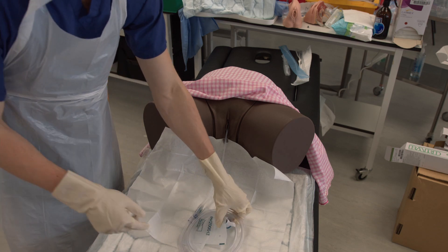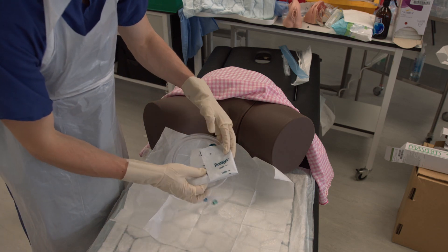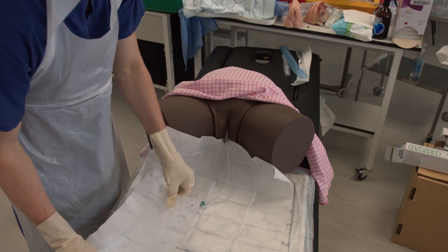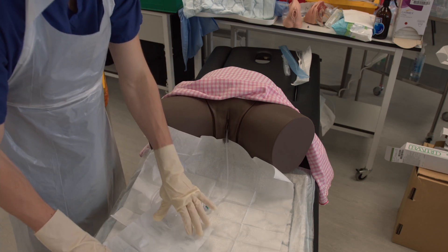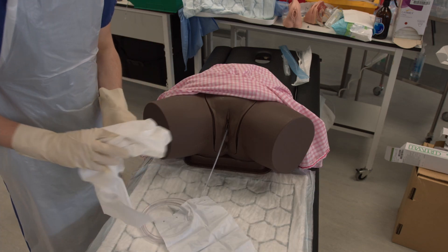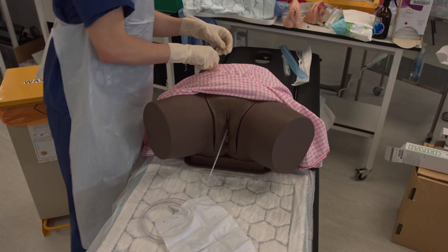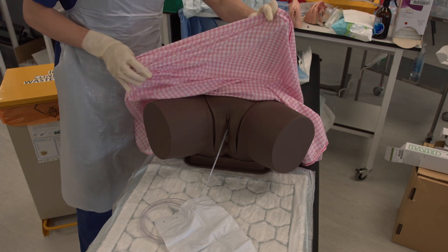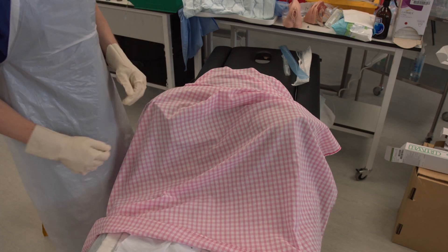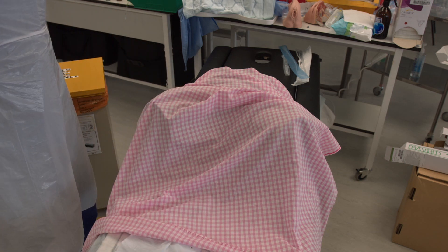Open out the catheter bag and place it on the bed. Then remove the protective sheet and cover up the patient.